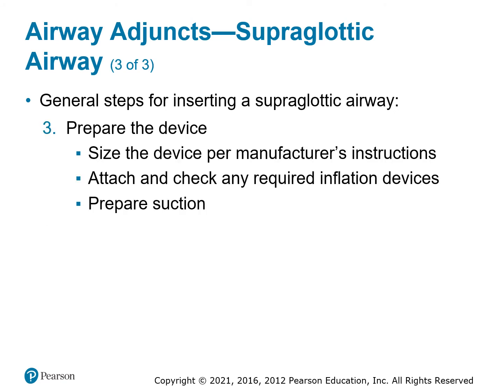So prepare the device. You're going to size it per the manufacturer's instructions, whether it's the King Airway or the I-gel. Back in the day, we used a combi tube, which is very large and bulky, and I don't think anybody uses the combi tube anymore.